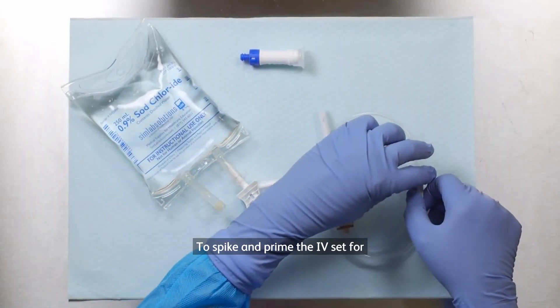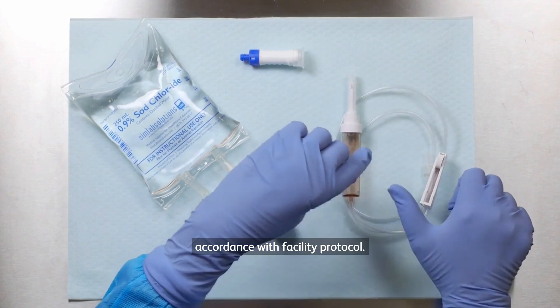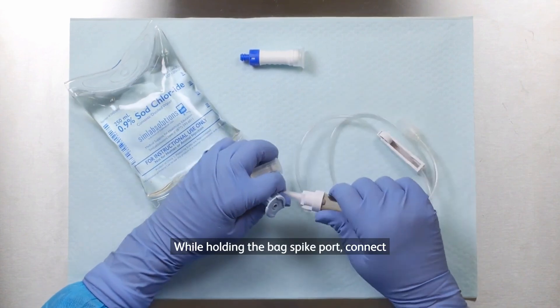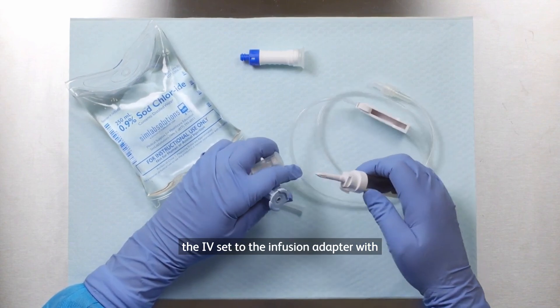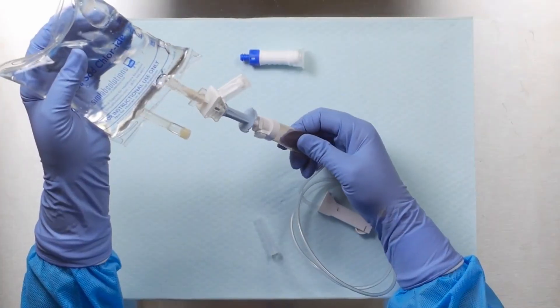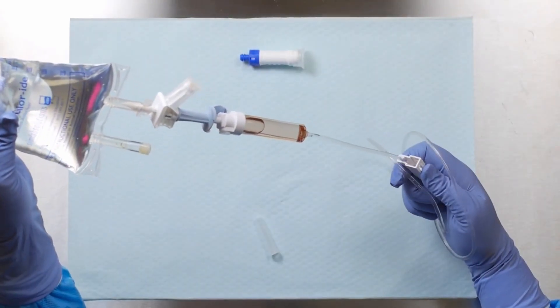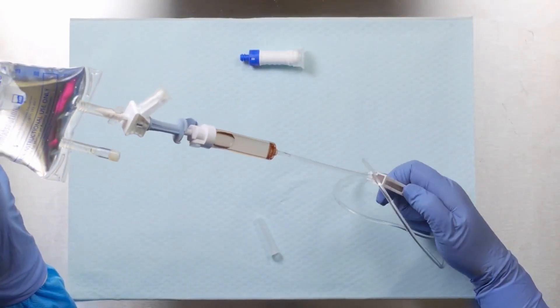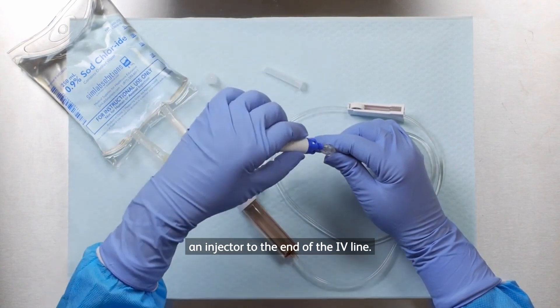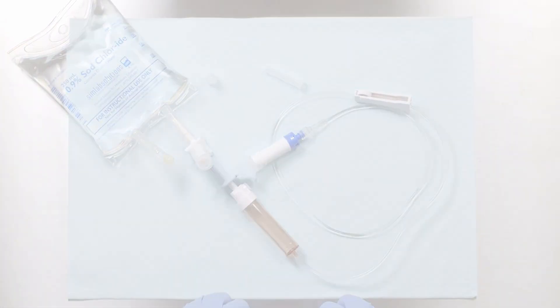To spike and prime the IV set for administration. This may be performed before or after drug transfer in accordance with facility protocol. Open the blue protection lid on the infusion adapter. While holding the bag spike port, connect the IV set to the infusion adapter with the infusion container in horizontal position. If required by facility protocol, attach an injector to the end of the IV line. Ensure all luer lock connections are securely tightened.